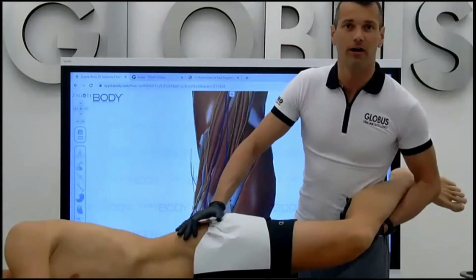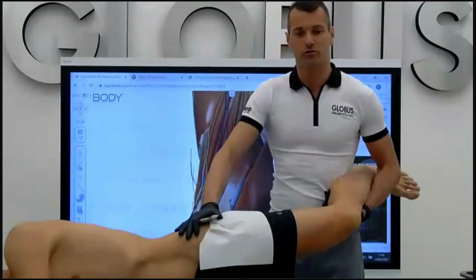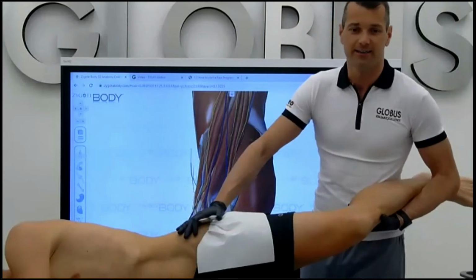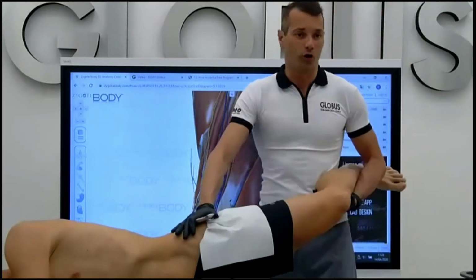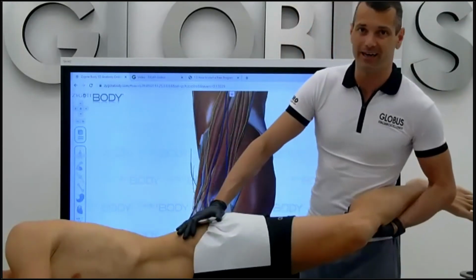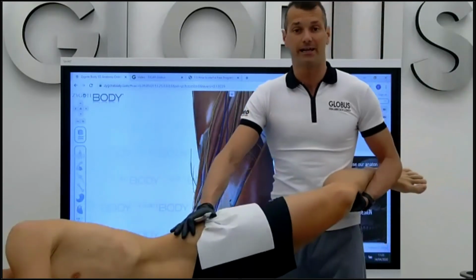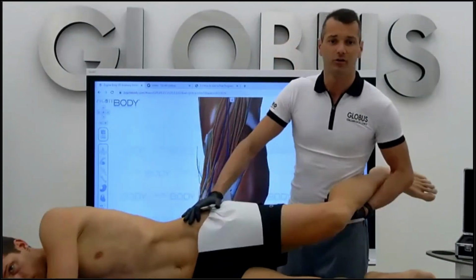But there are no protocols on the machine? No protocols on the machine for the fascia. There are all the protocols for the typical, traditional, I can say classical pathologies. The basic principles are almost the same. Actually, we need to become more confident with the use of the tools, with the use of the techniques, and combine it with the device. But it's nothing really complicated.